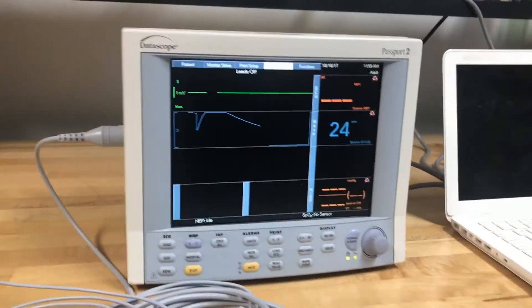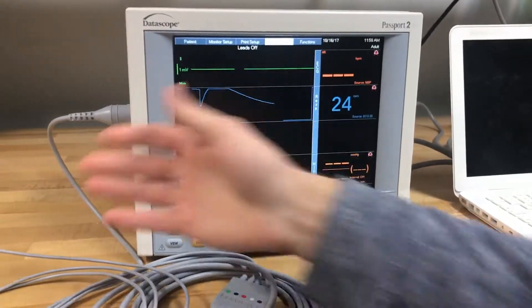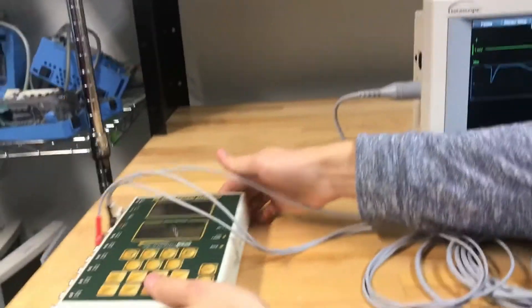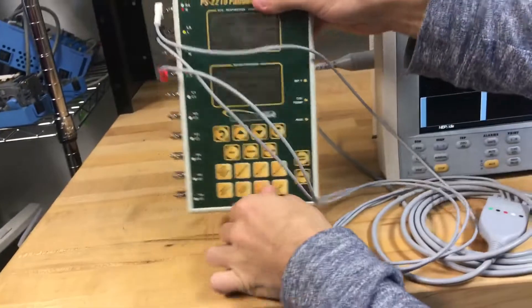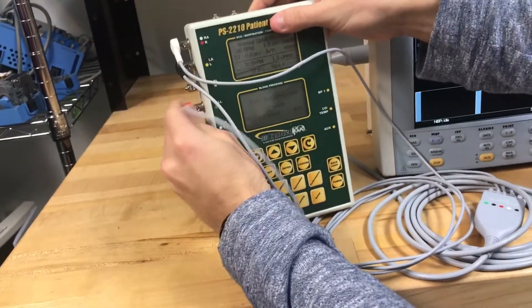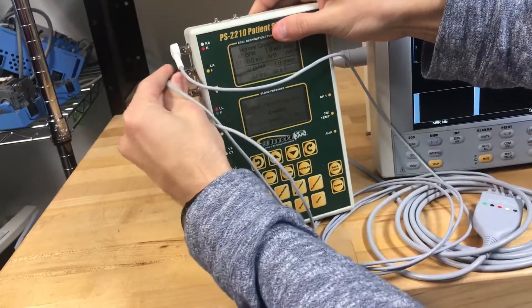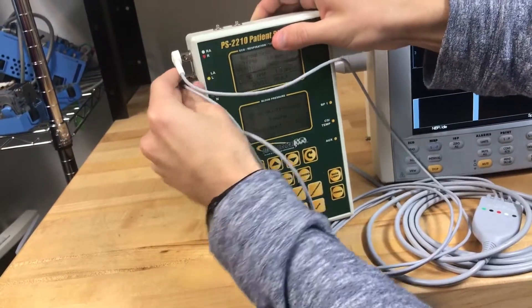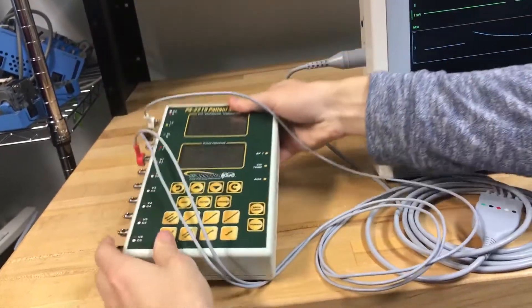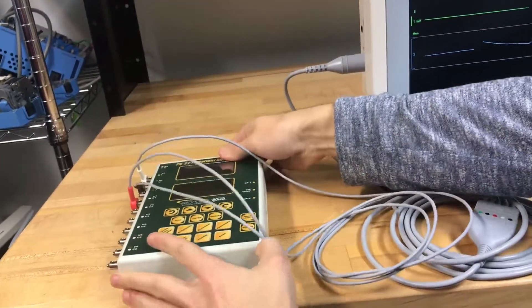First, re-verify the connections of the ECG leads to the patients. We have an ECG simulator, but you'll be making sure that the leads are making good contact with the skin.